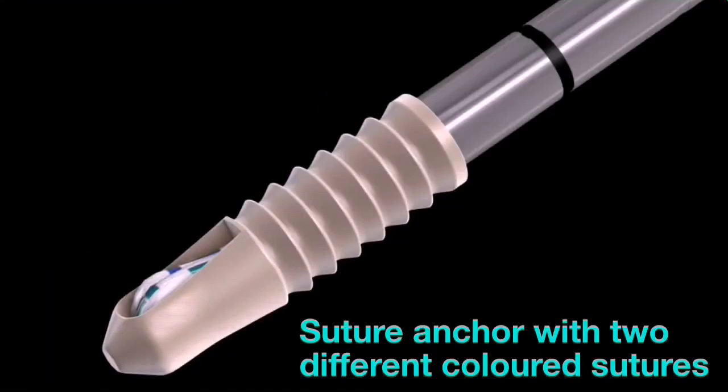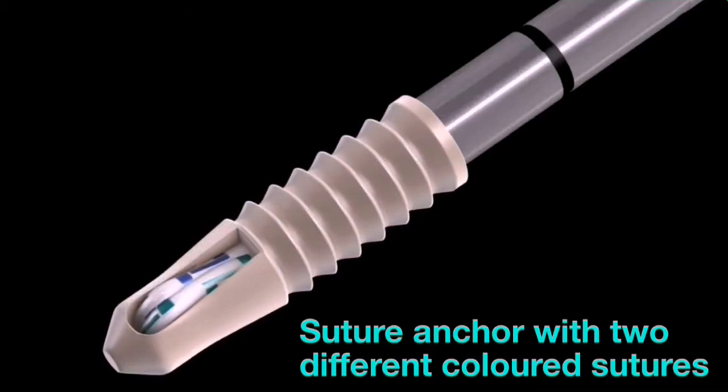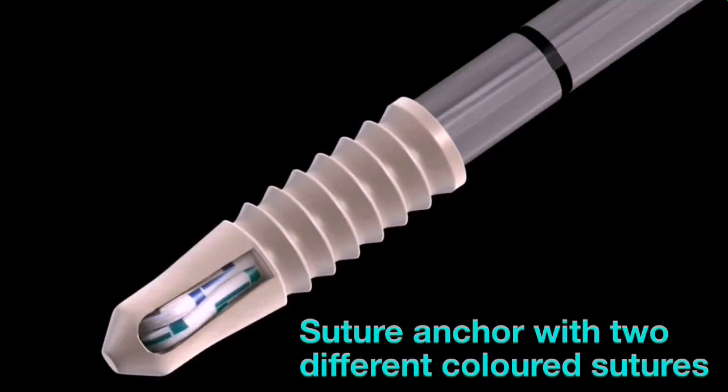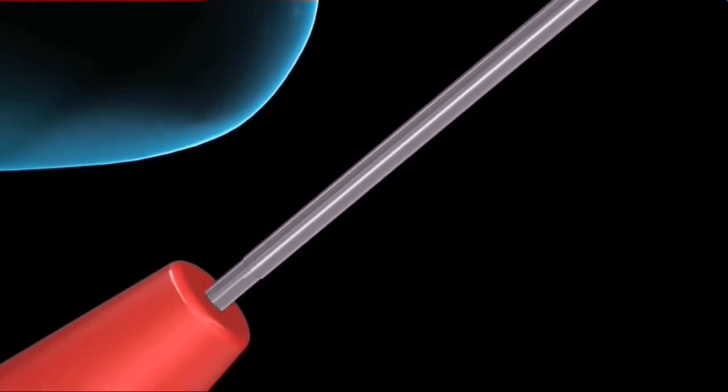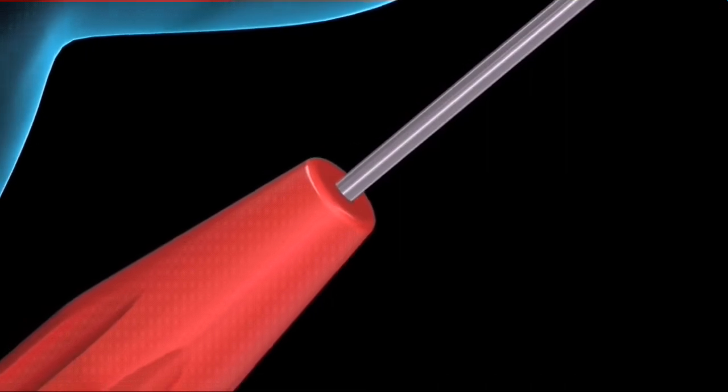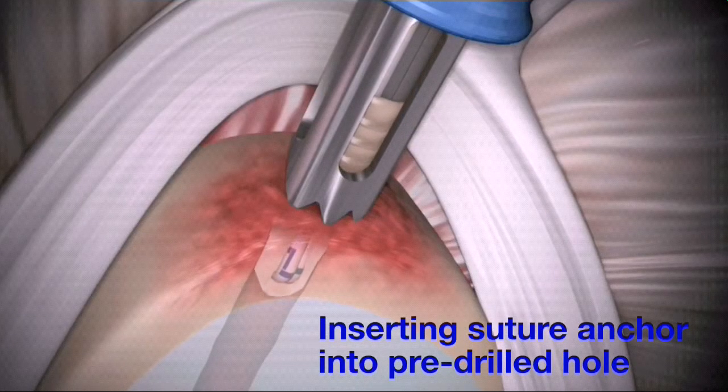Prior to insertion, align the vertical suture eyelet of the PRESS-FT to face toward the biceps tendon and superior labrum. Pass the PRESS-FT implant in through the drill guide and into the pilot hole.